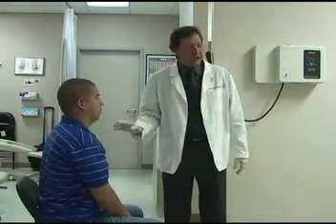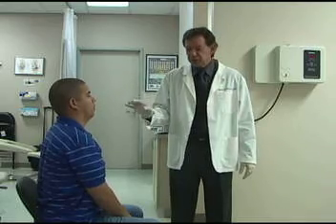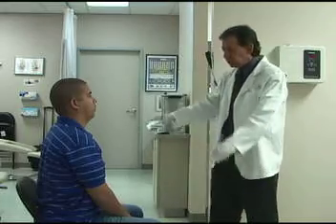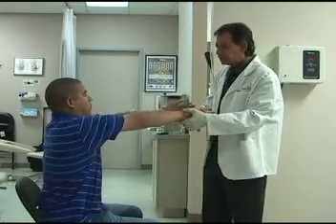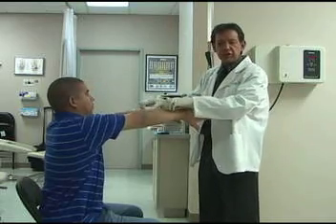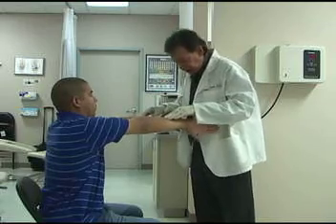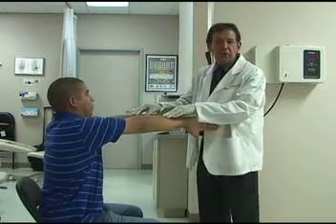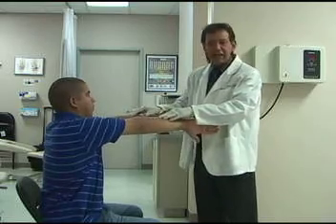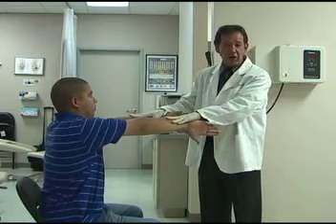So now, with the bite registration in place, we're going to see whether or not this corrects the neurology for this patient. So we'd like to see if we put you in the PCSD5 position, okay, and hold that. I'm going to apply a little pressure. We're going to create a stimulus to see if there's a reflex reaction, and now there's no response to that. It is no different than doing the other side, so now he's reacting as anyone would who had a normal TM joint without any pathology.